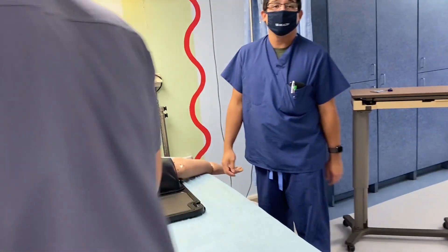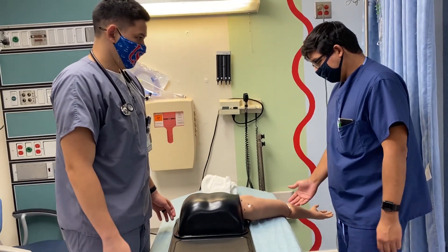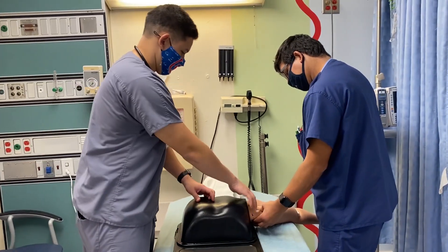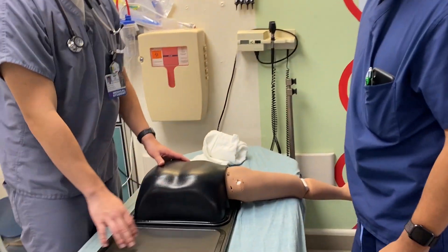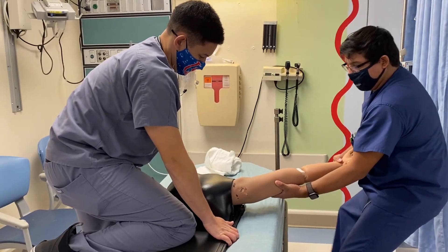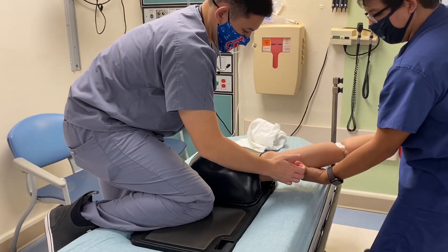Now we'll demonstrate how to reduce an inferior dislocation. With an inferior dislocation, the arm presents extended up over the head. We dislocate it inferiorly and then apply superior traction to reduce it.